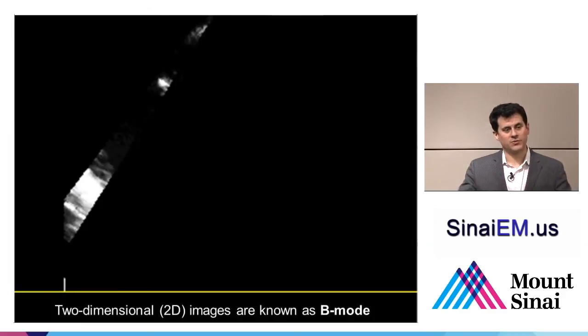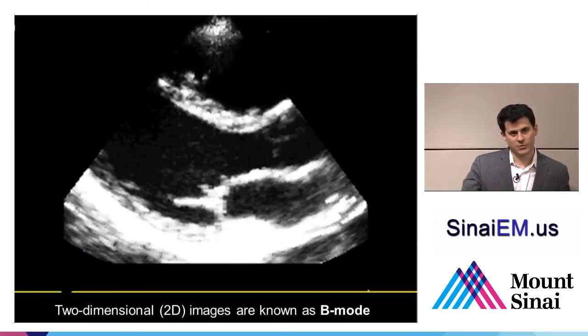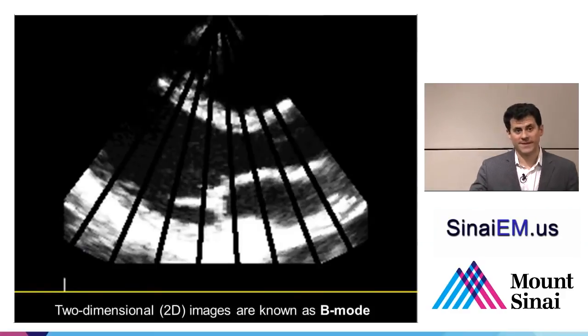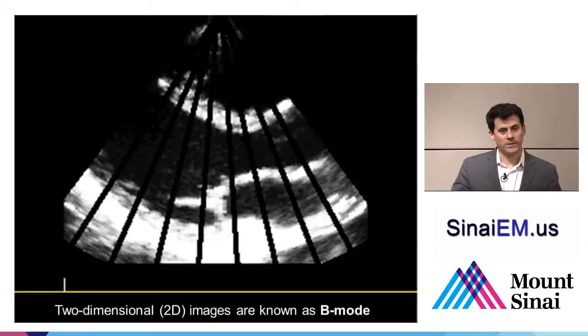It bounces off of structures and it reflects back to us. We then turn the direction slightly to the side and send it out again and back, and turn it and send it out again and back and over again. And when this linear process of sending a signal straight out and straight back is repeated over and over again and fanned back and forth, that one-dimensional line turns into a two-dimensional image.